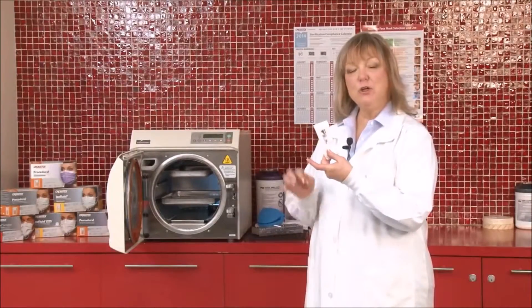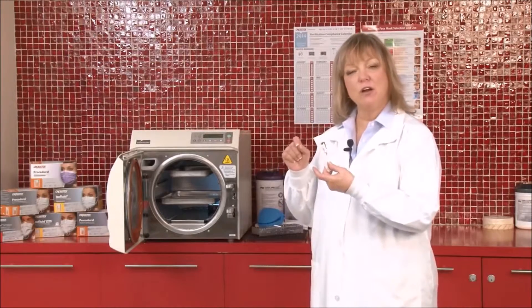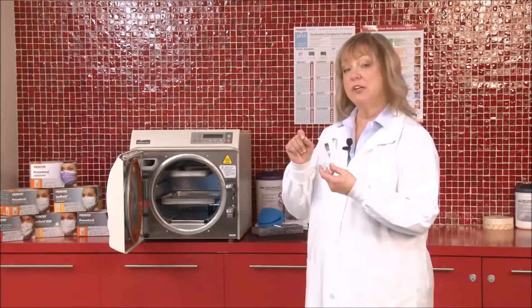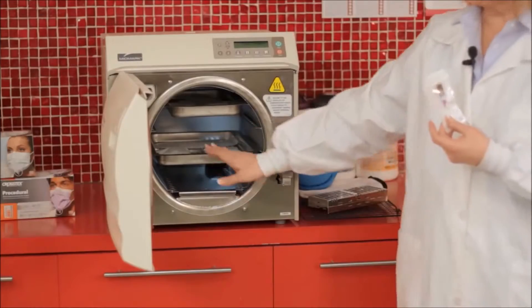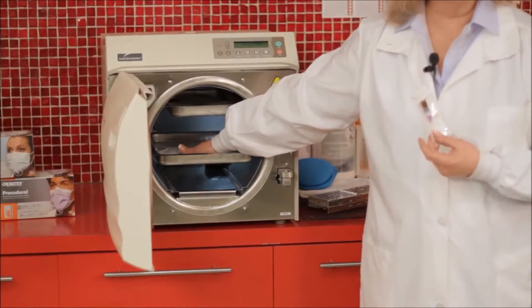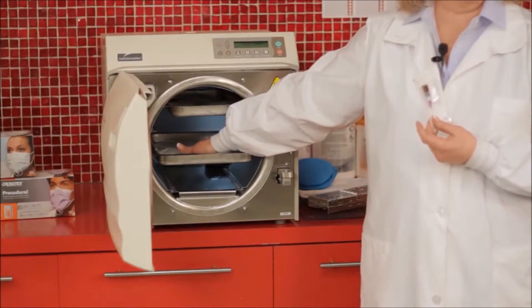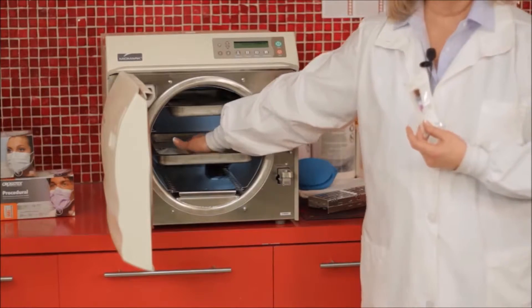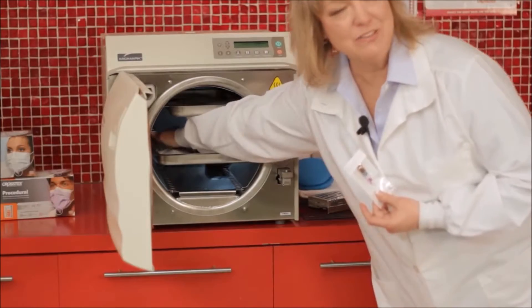When you place the vial, you want to place it in the most challenging part of the sterilizer. That means the place that you're most likely to have an air pocket. That area is going to be on the bottom tray of the sterilizer. It's either going to be over the drain, which may be in the middle of some autoclaves. In other autoclaves, it's in the very back left-hand corner.